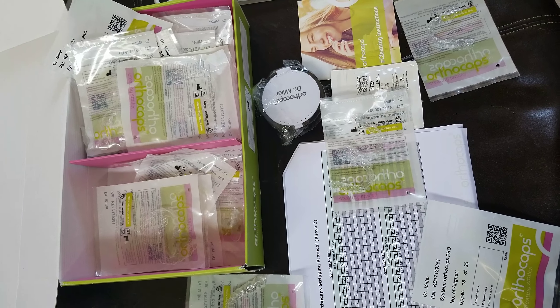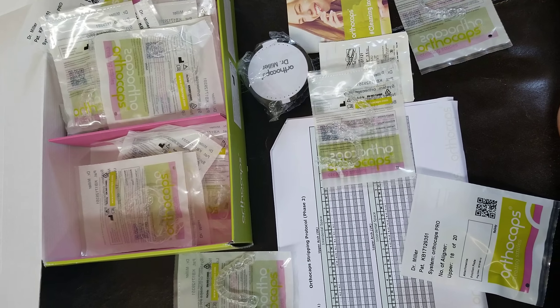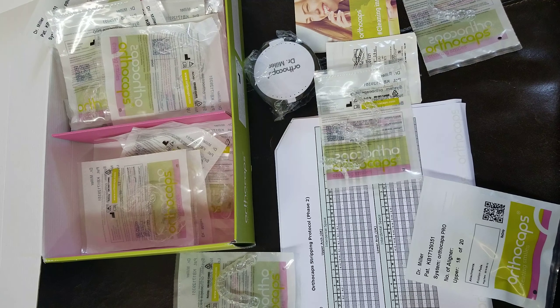I'm Amanda from Straight Smile Solutions and today we're doing an unboxing video of Orthocaps, which is one of the newest aligner systems to get its 510K clearance. It's been around for almost 10 years based in Europe but it just got its US 510K clearance. RMO is a distributor. I'm just doing an informative unboxing video — before anyone freaks out, it doesn't mean I'm working for them.